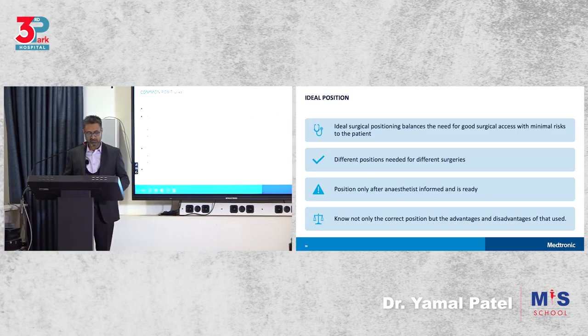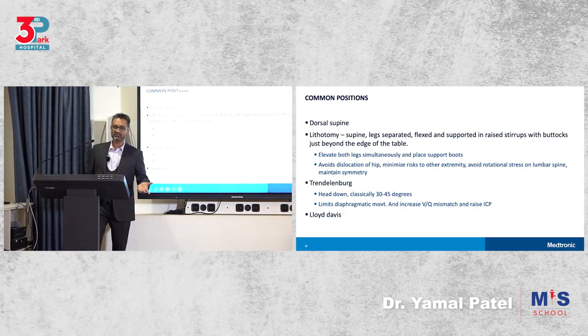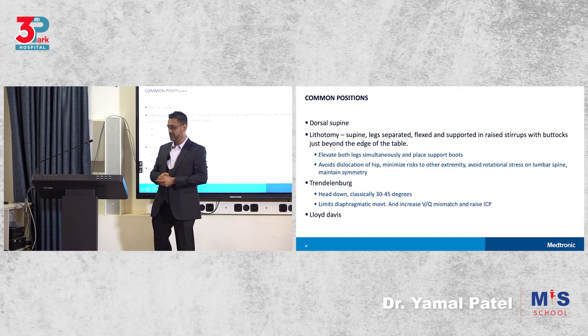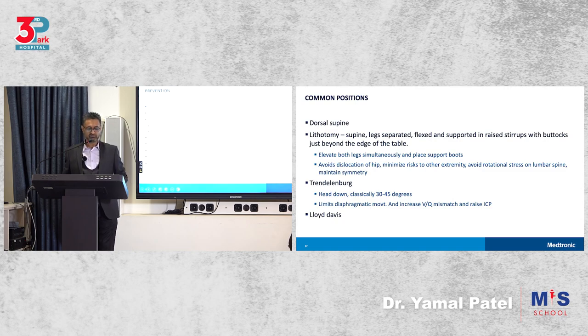So you should know the correct position. Now, what are the common positions we use in gynae? We have a dorsal supine position. We have a lithotomy position. We have a semi-lithotomy position, which is the Lloyd Davis position. And then we have a Trendelenburg position, where we have a head down position that we would use.